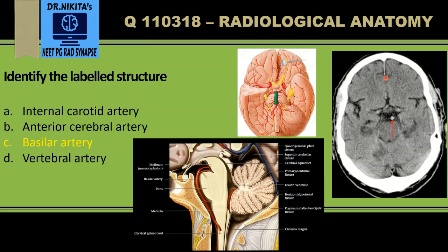So the anterior cerebral artery, middle cerebral artery, and the terminal internal carotid are identified here, this is the basilar artery, and here would be the posterior communicating artery. Therefore, the labeled structure is the basilar artery.